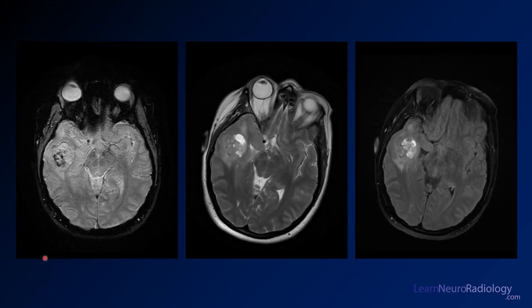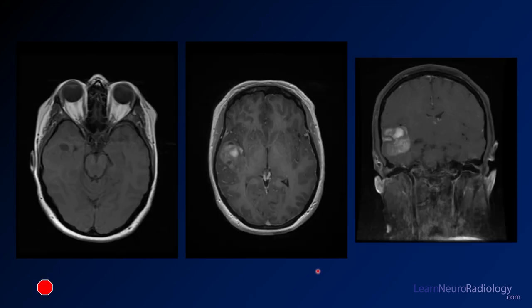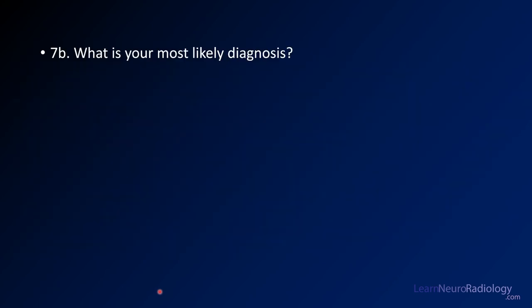Now we're going to take a look at some more images from this case, similar to one of these ABR two-part questions where you have to click through. We have blood-sensitive GRE imaging, a T2 in the middle, and a FLAIR on the right — you've got that abnormality in the right temporal lobe. Here's your pre- and post-contrast imaging: axial pre-contrast, axial post-contrast, and coronal post-contrast. We did see a little calcification, so your question is: what's your most likely diagnosis?